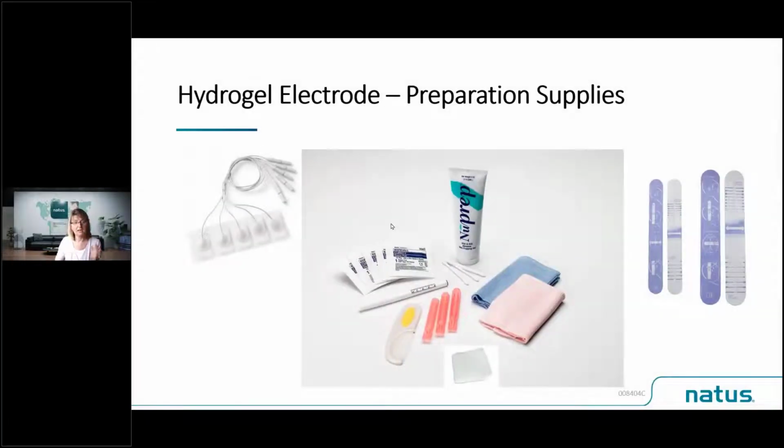The first thing I'm going to cover then is the procedure and the application and the preparation with hydrogel electrodes. Now, the one thing to remember, particularly with hydrogel electrodes and cup electrodes, skin preparation is the most essential component. Taking your time to prepare the skin, to remove any debris, oil, move the hair, is the most crucial element to successful electrode application. So the next few slides are going to discuss hydrogel electrode infant preparation, and then we'll go on and we'll cover needles and we'll cover cup electrodes.